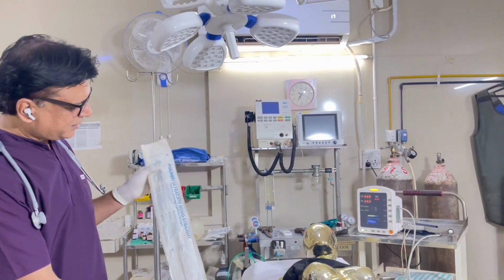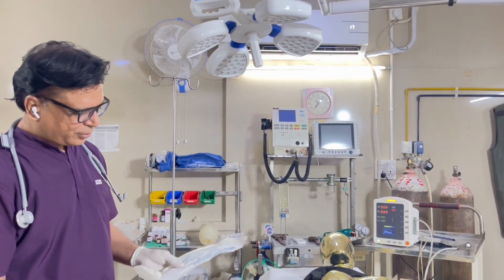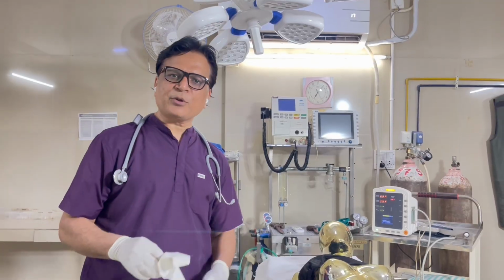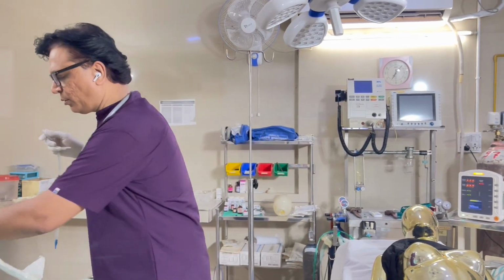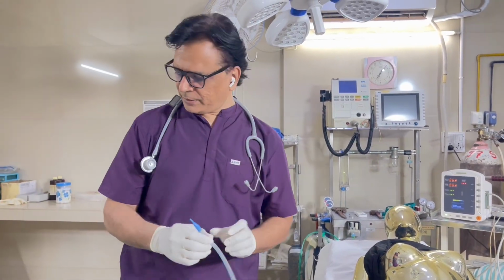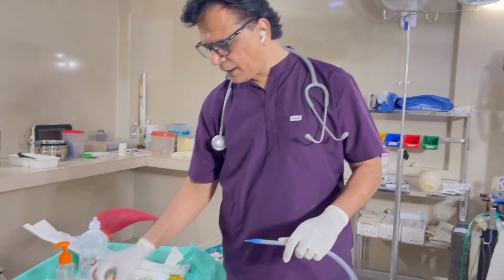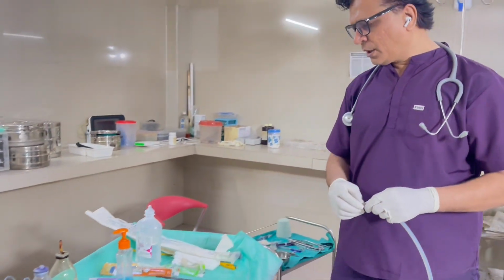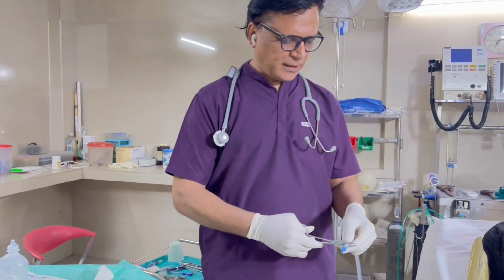This is the chest drain. See the expiry date and the number of the drain. For pneumothorax, it should be around 28. Once you see the drain, you see the end. If there is a trocar inside, you have to remove the trocar. If the end behind is not locked, you can put an artery forceps like this.